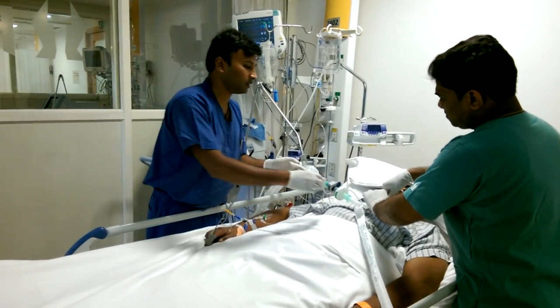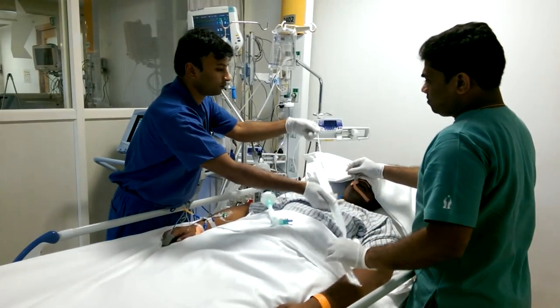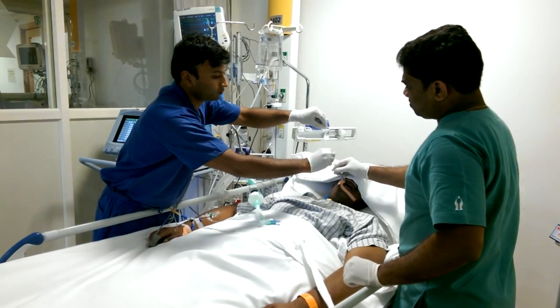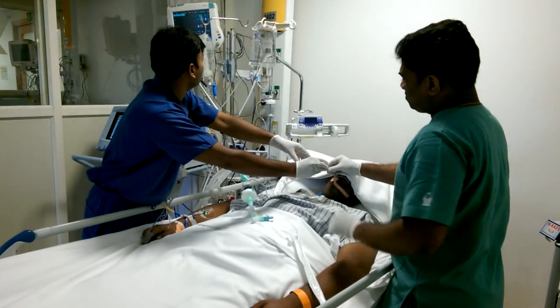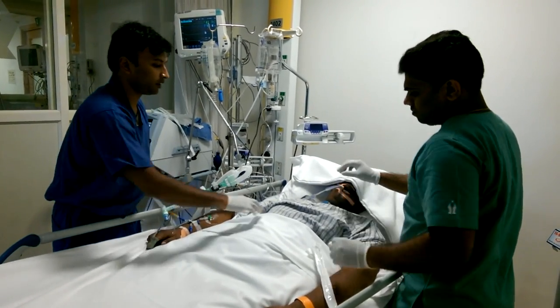We are disconnecting the tube. We are inserting the catheter. We have to make sure that the saturation doesn't drop, and we watch for respiratory efforts.